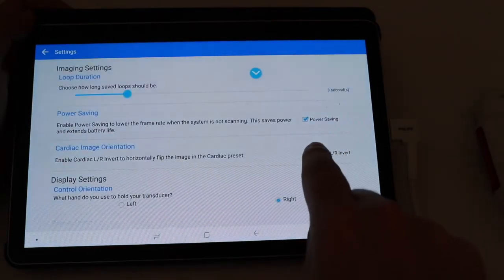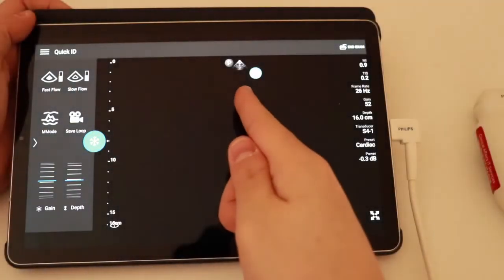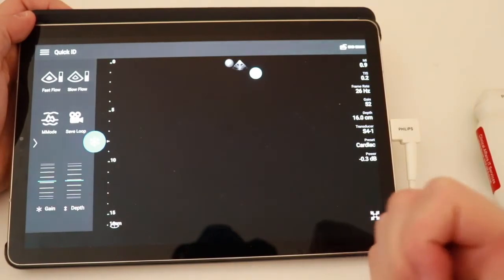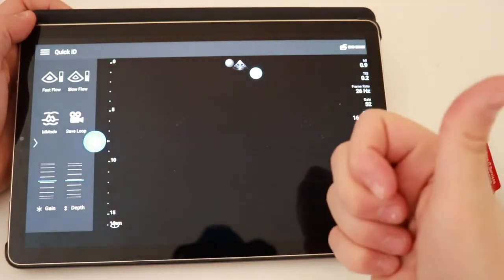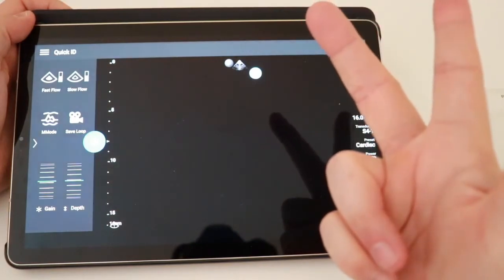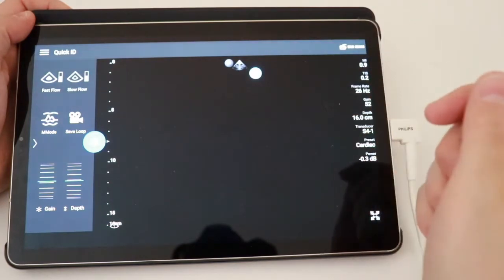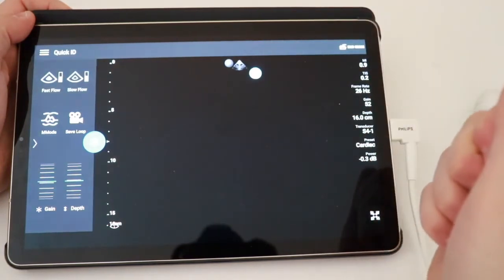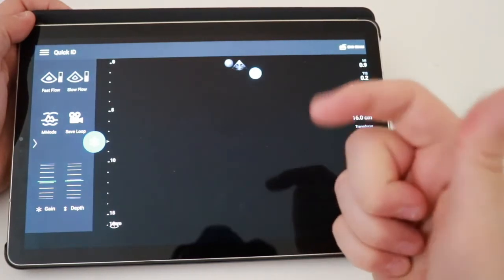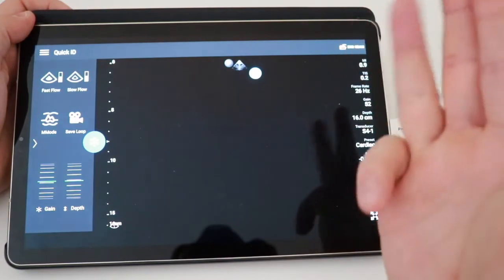Cardiac, left, right, invert. We're going to check that, go back, and once again, the indicator is over on the left side. So that is the Philips probe. Again, we're going to be using this primarily for cardiac, OBGYN, abdominal aorta, any sort of abdominal exam such as FAST exam. We're not going to be using this, again, for superficial structures, so not for vascular access, not for musculoskeletal, not for nerve blocks, and not for soft tissue.